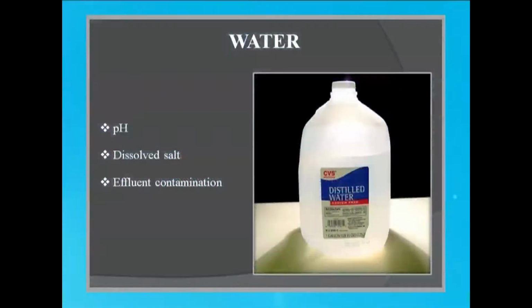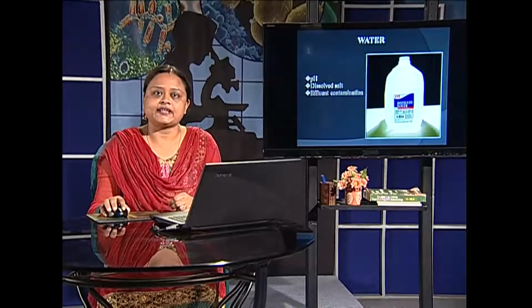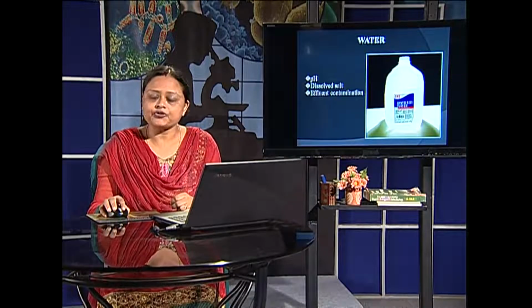Water is often required in the industries for a lot of activity and as required, deionized, distilled or even simply pure water of good microbiological quality can be used. It depends on where it is exactly getting used, whether for production of steam or to be actually used in media.